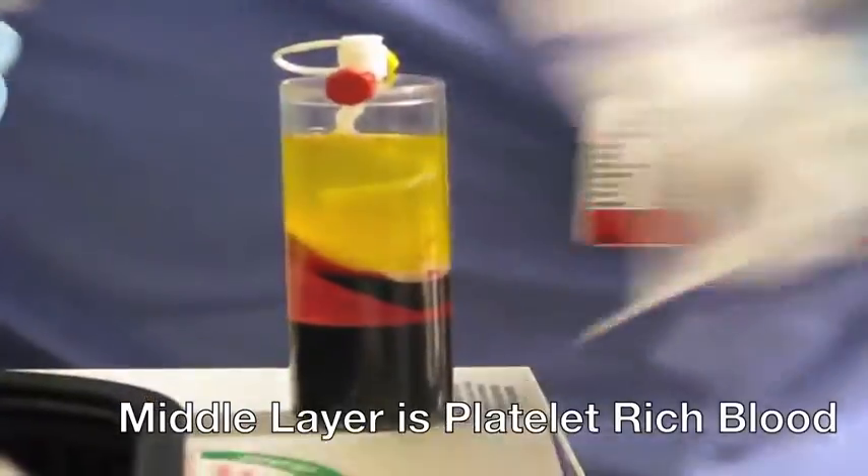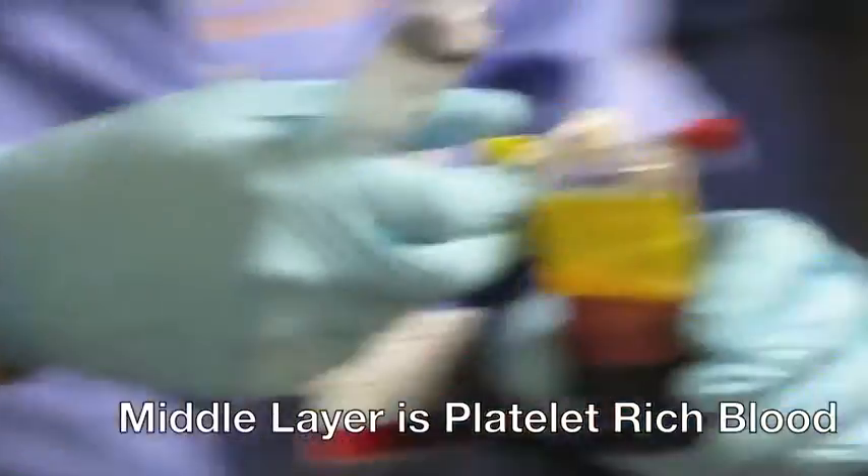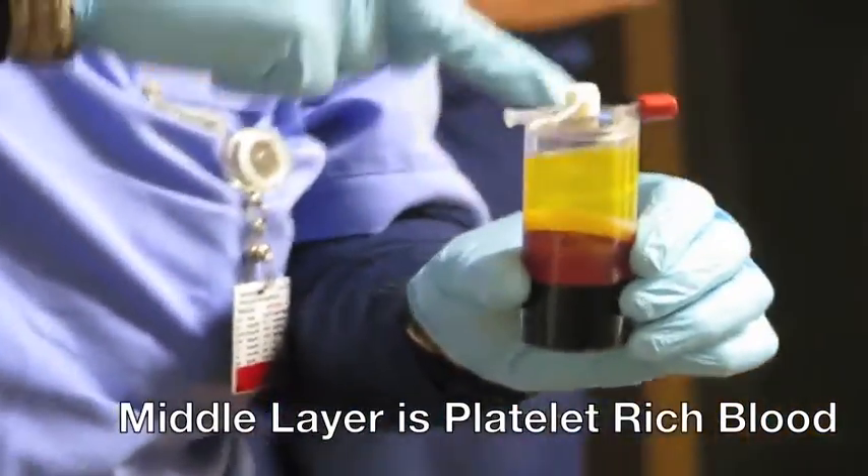Here you can see a container after it's been spun down in a centrifuge. This is the PRP in our injection tube.